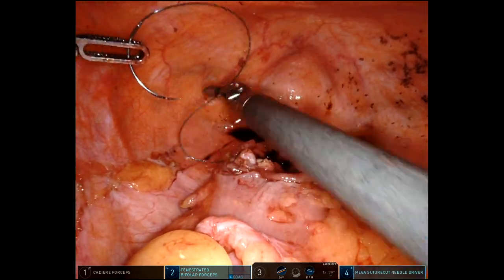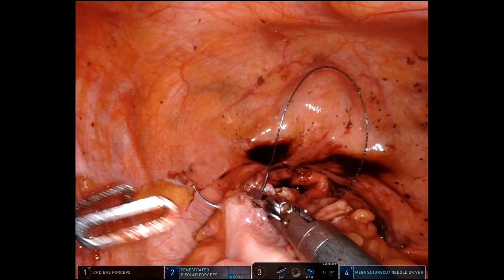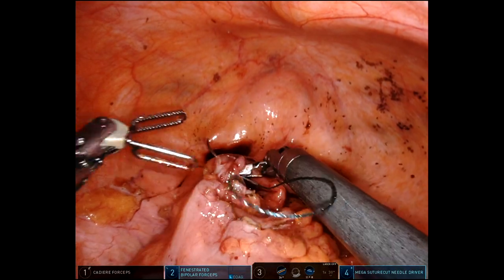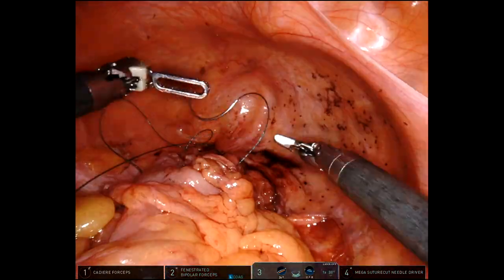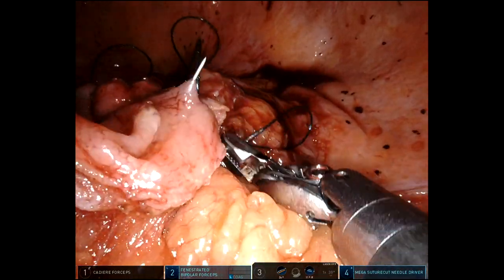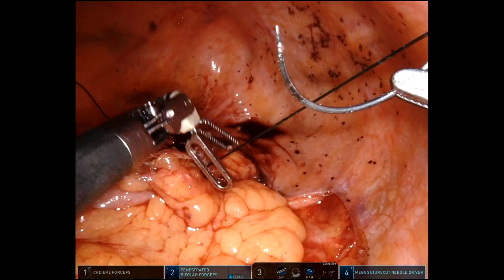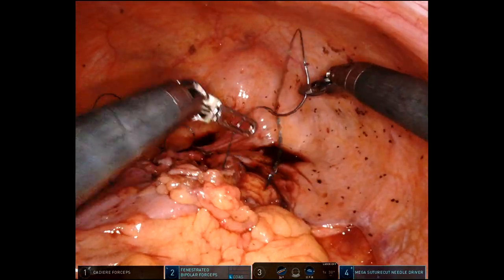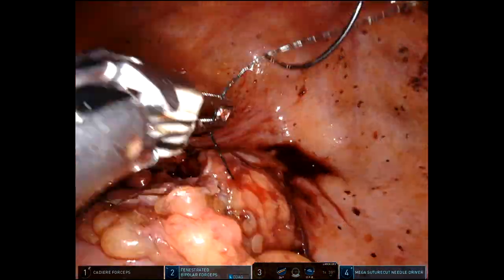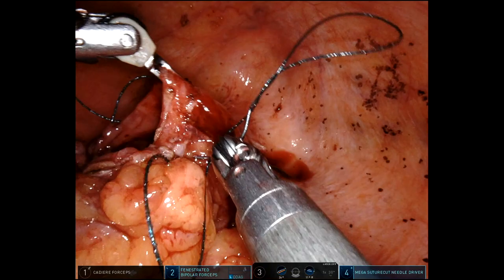Getting the looping out of the suture and continuing on. Right about here I'm getting ready to start canneling — I turn the needle around to bring it to the outside and canal over the top. I don't bring this too far in the beginning because I don't want to close that anterior lip before I can see the posterior aspect of the anastomosis. I'm starting my second 3-0 V-Lock in the posterior midline, going out and around the right side. I do wonder — prior to ICG — if I had seen an anastomosis like this and not revised it, whether it clinically would have been insignificant. I truly don't have the answer. I just don't have the courage to have left something like that.